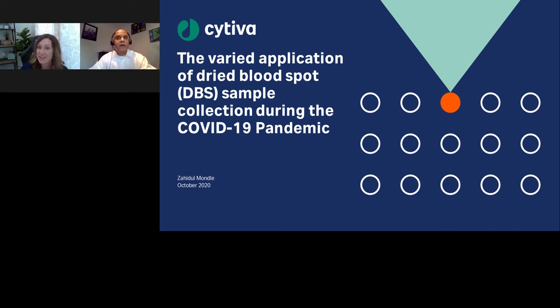Can you speak to other sample collection methods that you've used? I already discussed the finger pricking sample collection. It involves taking a very small amount of blood from the patient, usually from the end of the finger. But arterial sampling, which is close to the palm, and this blood sample commonly takes place within a hospital environment. Arterial sampling is used in the identification of metabolic, respiratory, and mixed acid-base disorders where carbon dioxide levels require understanding or monitoring. There is an increased risk of bleeding complications in patients with coagulopathy.